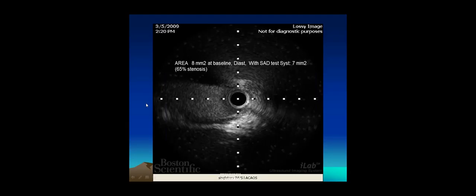I don't know what to make of that scar or myocarditis that they found in the free wall. Evidently, that is not the typical finding of Takotsubo either. The myocarditis that you're talking about, the MRI, do you have a picture? Did you see a picture of that? We don't have it here. No. That other MRI, I just thought about it, wasn't the late gadolinium. That's just a white blood study.